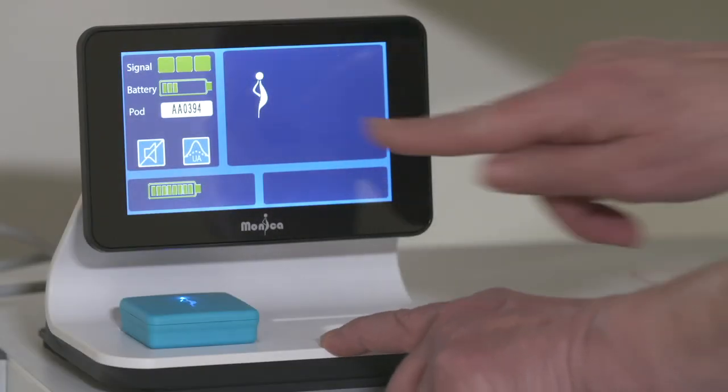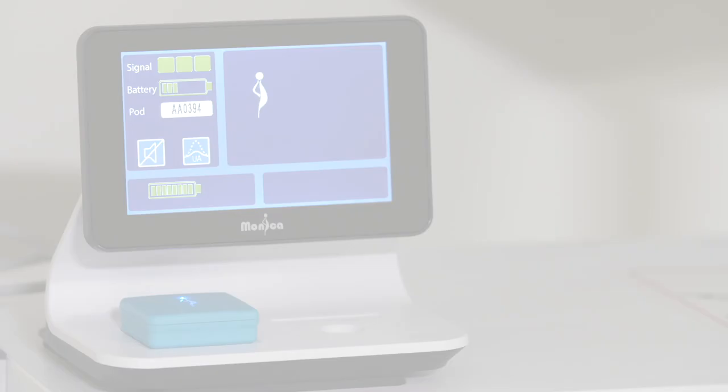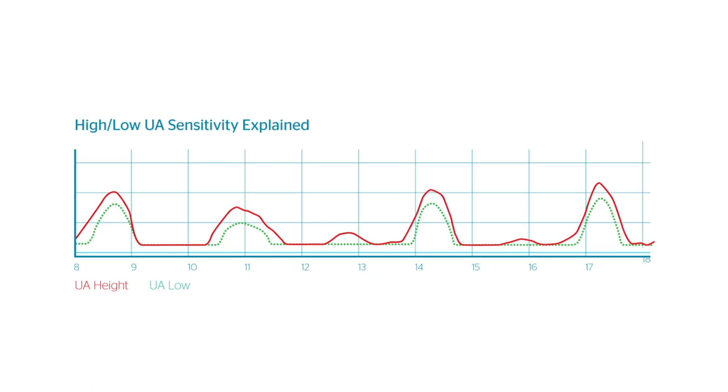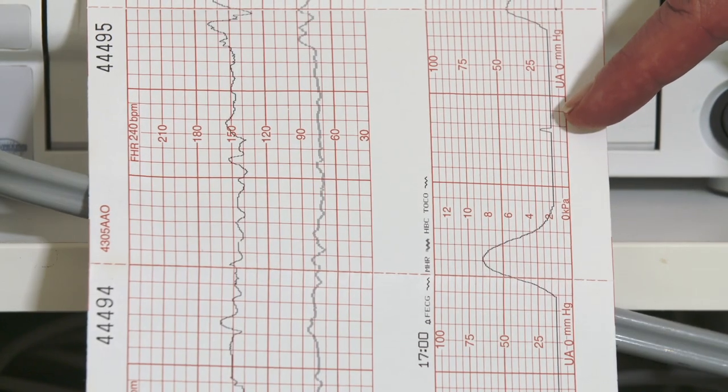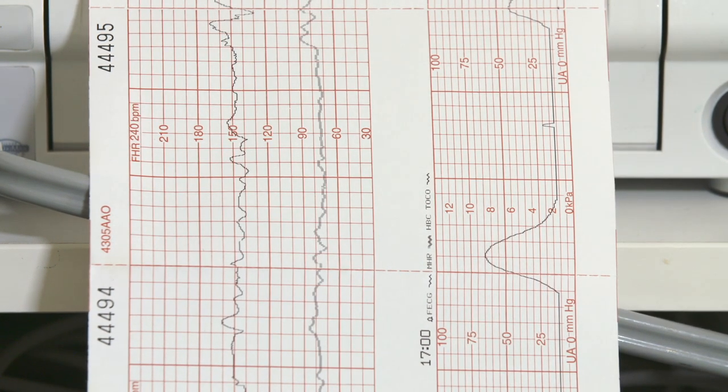High UA sensitivity is the default startup condition when monitoring commences and is the correct setting for established labor. In pre-labor, the UA trace can look hypersensitive due to small deflections. Using the low sensitivity setting will decrease the UA amplitude, suppressing unwanted low amplitude UA, but it will also reduce contraction duration. For this reason, when you select low UA sensitivity, it will automatically switch back to the high setting after 60 minutes. The Monica identifier spike is reduced in height by 50% when the low UA sensitivity setting is selected.